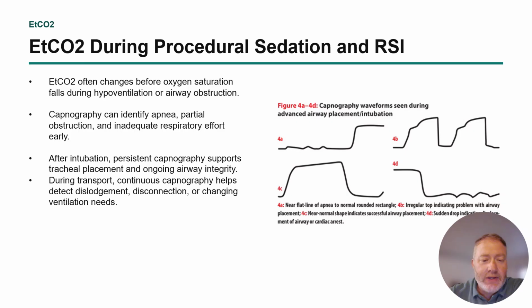So the end tidal often changes before oxygen saturation falls during hypoventilation or airway obstruction. So that is important to kind of trend as well.